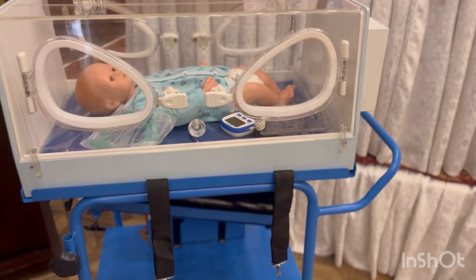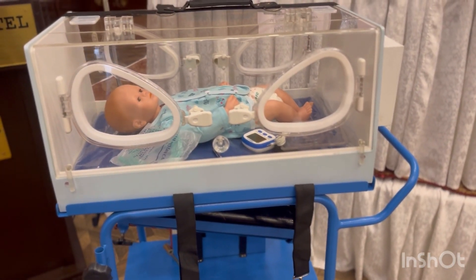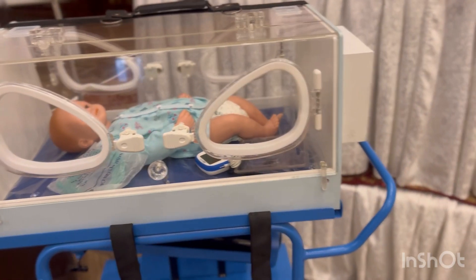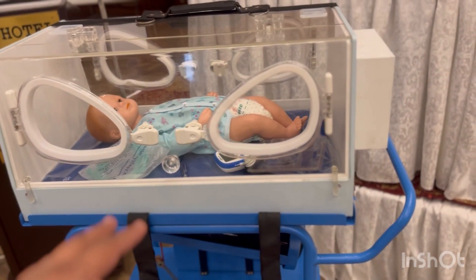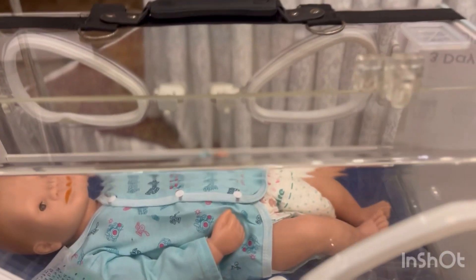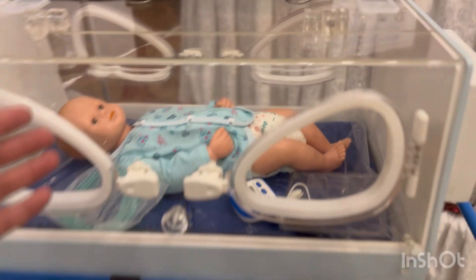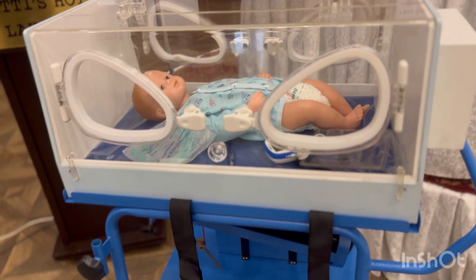You can use it to transfer a baby which is not ventilator dependent. The previous model which we showed you is actually imported and it costs about 10 times more. This is a cheaper version, but it does not have a portable ventilator with it.